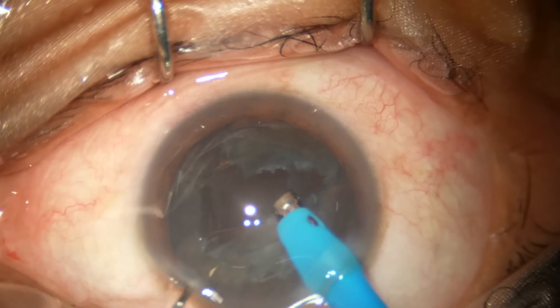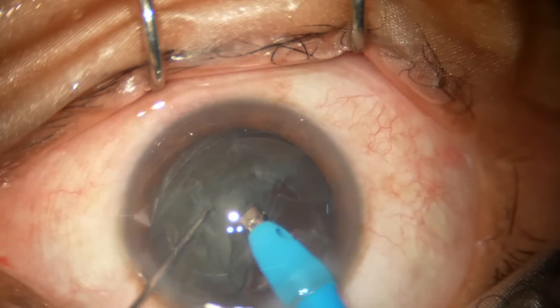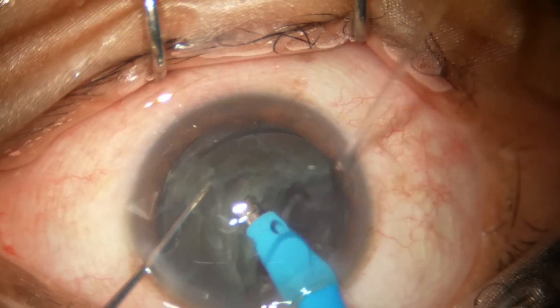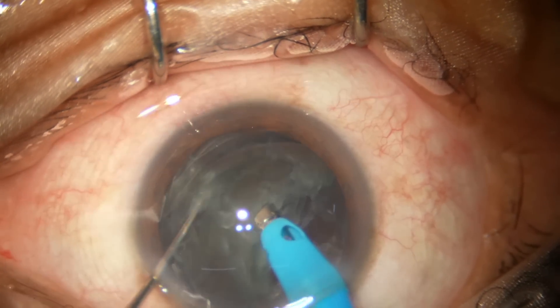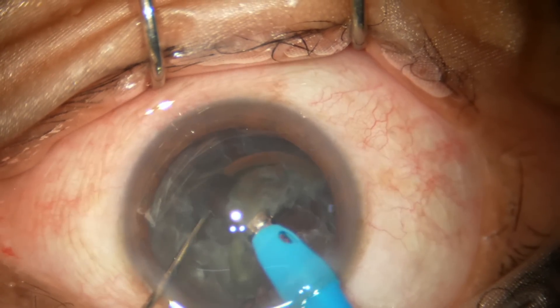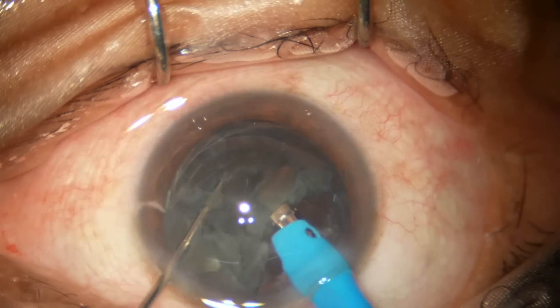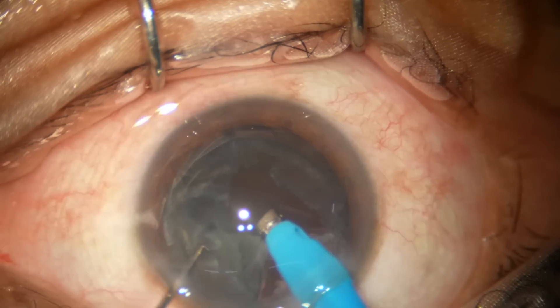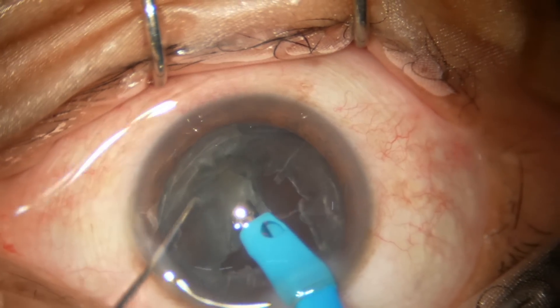I will not remove the epinucleus at this moment — it is going to protect the posterior capsule as long as it is there. So I will hold and chop this nuclear piece and emulsify it. There is another piece — this is the last piece — and now the epinucleus.